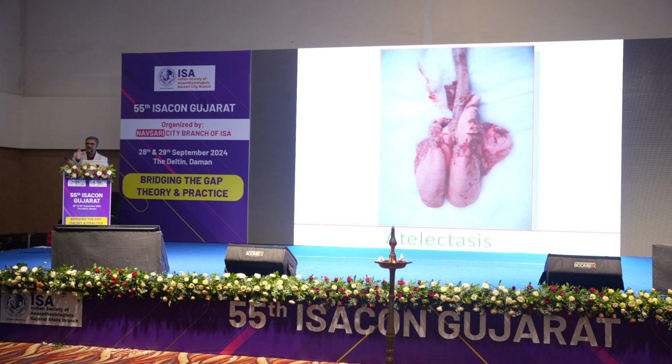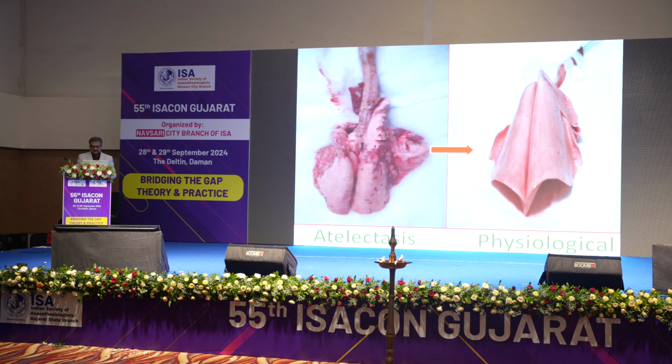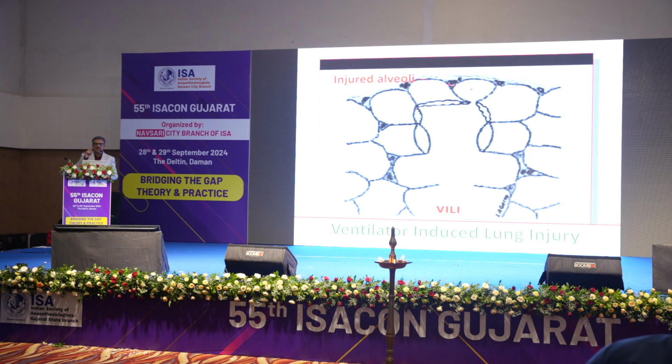Another point, with conventional ventilation, even a couple of minutes of ventilation can lead to ventilator-induced lung injury. These 2 things need a change in the ventilatory pattern.